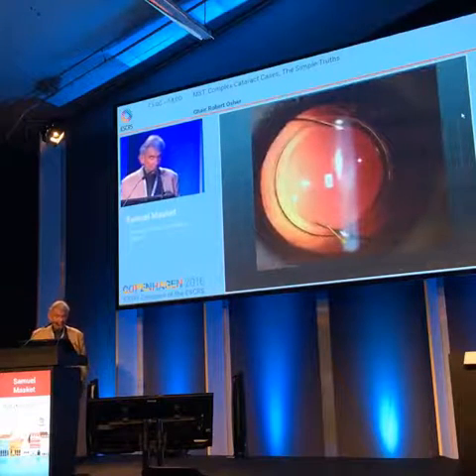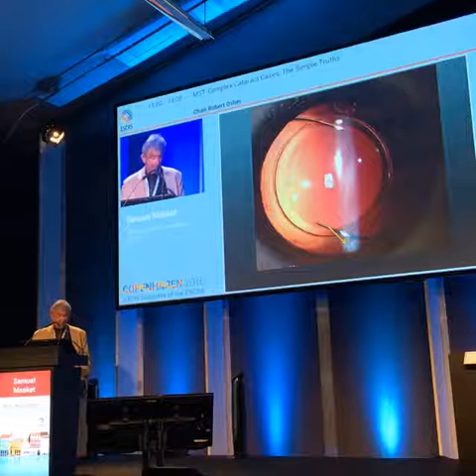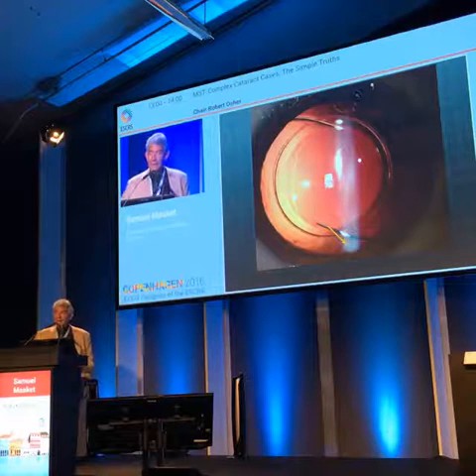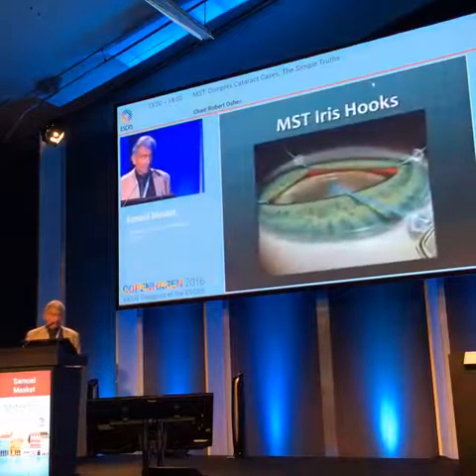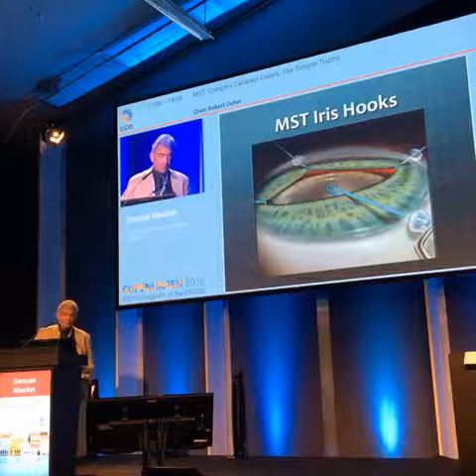And this is what she looked like some 6 months after surgery. And you can see the inferior extent of the anterior capsulotomy went this far, but she had a continuous capsulotomy and life was good. I aggravated very significantly over how to do that, and I think that tool really helped us.